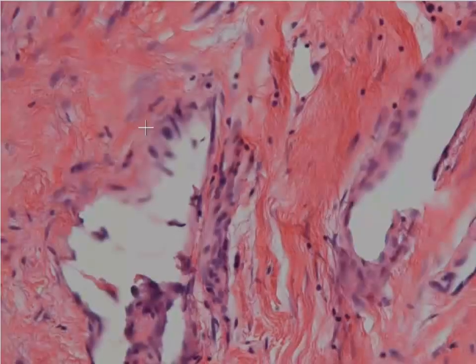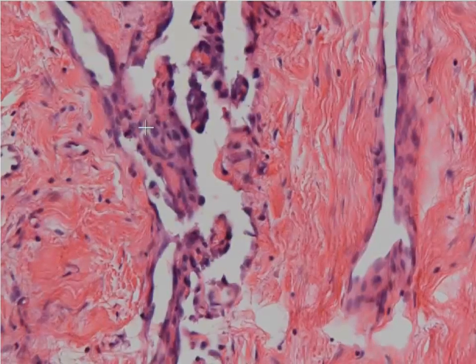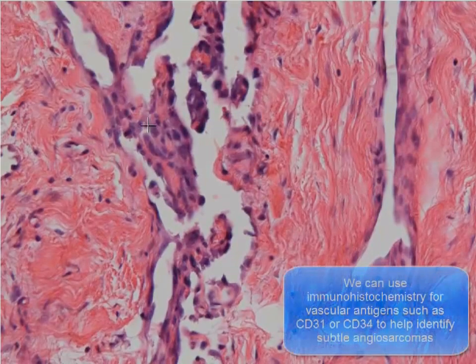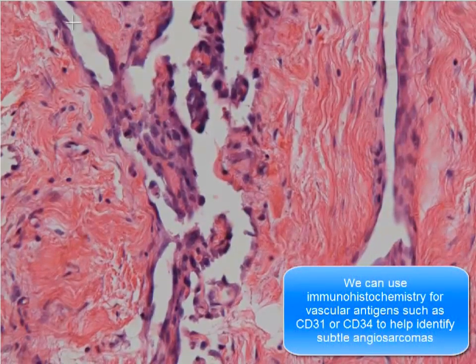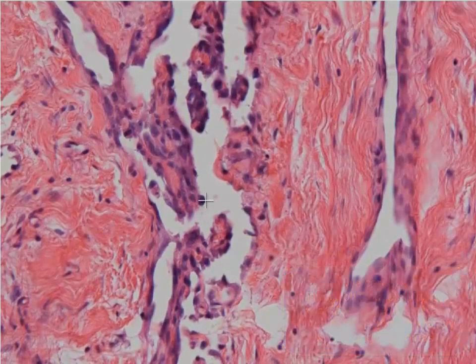Some of the features that we look for to help us with the diagnosis of angiosarcoma are atypical endothelial cells. When you look at the vascular spaces, you see that there are irregular and dark nuclei. A lot of them tend to pooch out into the lumen of the blood vessel, and you'll also have mitotic figures.